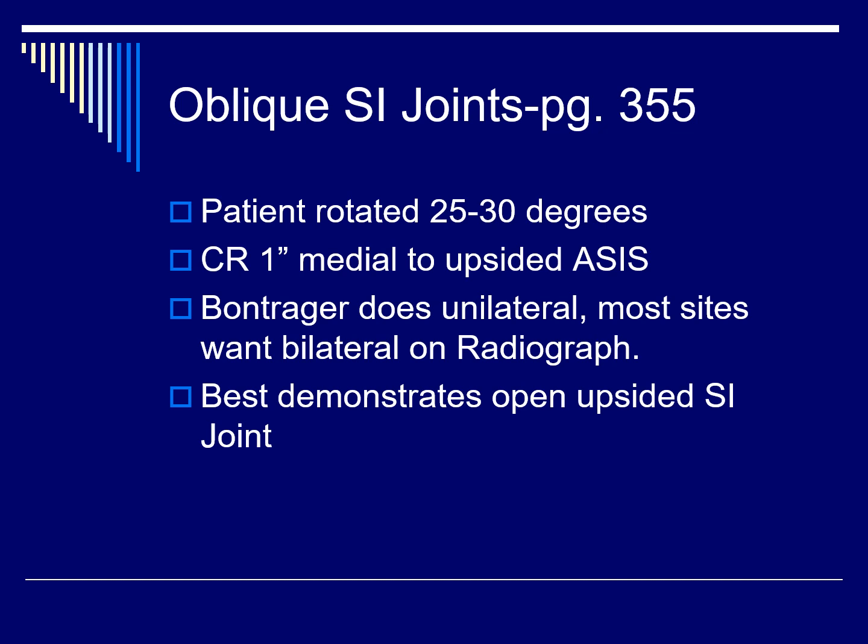On these, you're going to not follow the part closest to the IR rule, so you're actually looking at the upsided SI joints, because when you roll the patient into a 25 to 30 degree obliquity, that's actually going to make the beam perpendicular through that joint space.